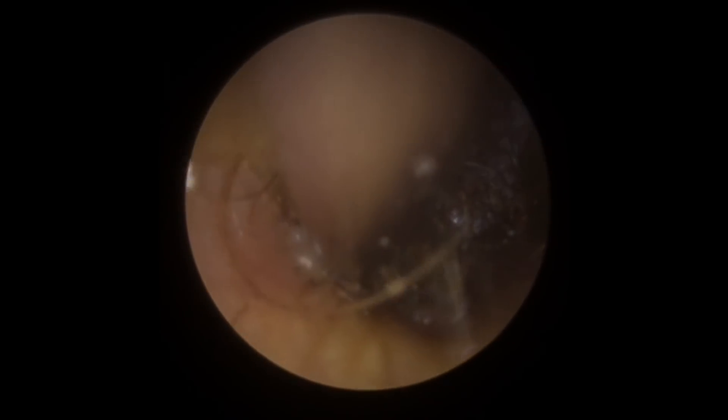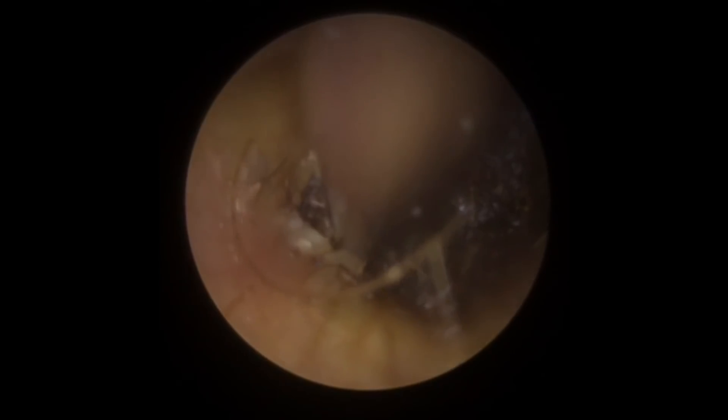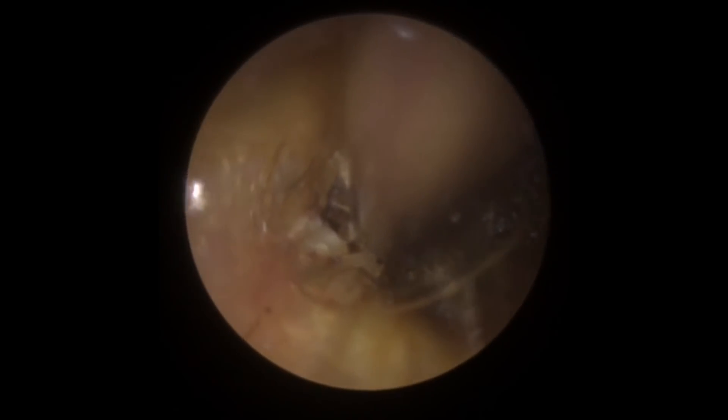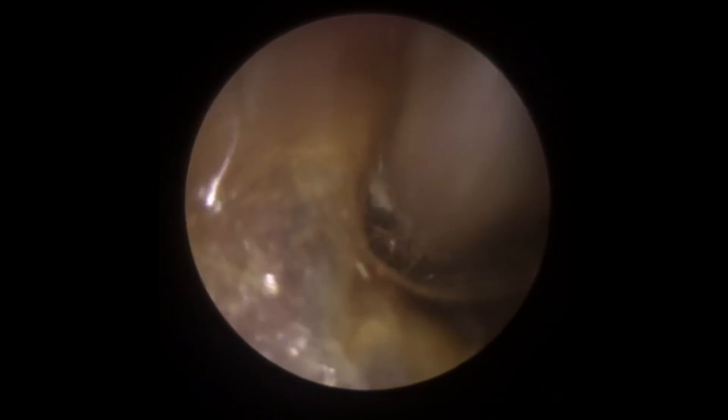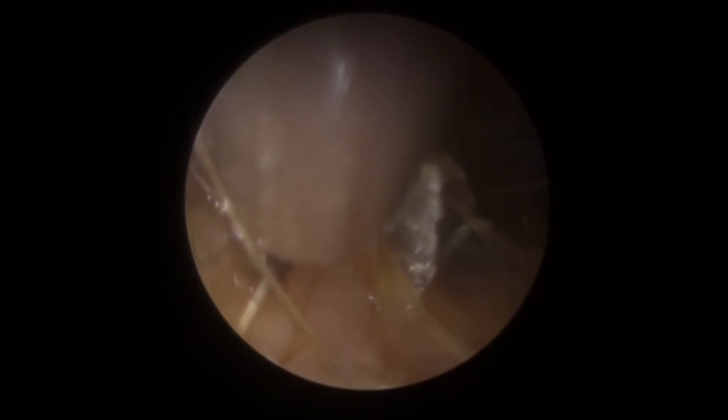I'm just going to stop the video now. I want you to keep an eye on this section here with the arrows pointing — watch what happens when we get a bit of movement. See that whole section peel away from the canal? What we have is one long strip of dry skin. That's why this hasn't been coming away very easily — we've got this whole strip of dry skin sitting in front of this wax blockage that's holding it all in place. Normally we wouldn't look this far back, and in fairness I didn't even spot this until it started to move.